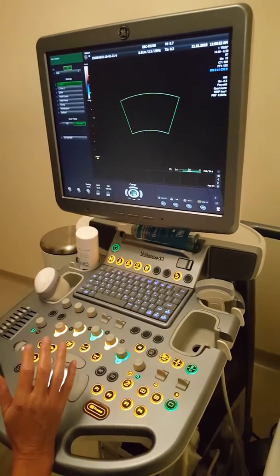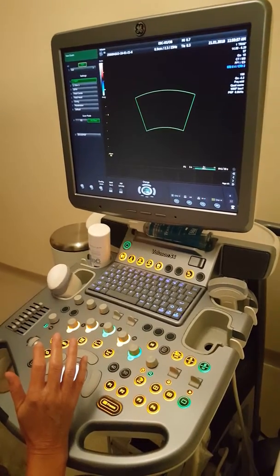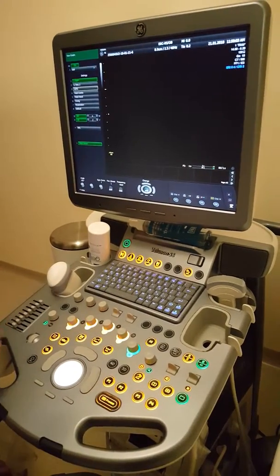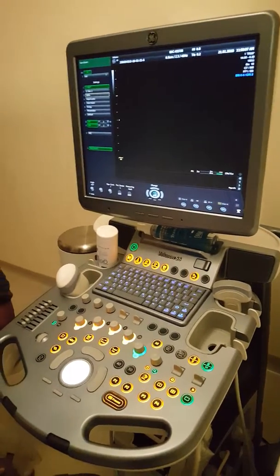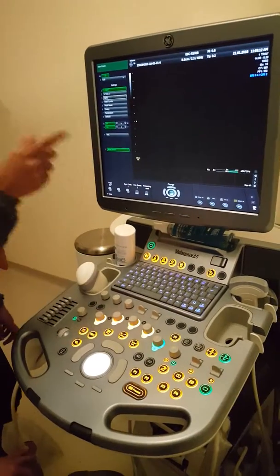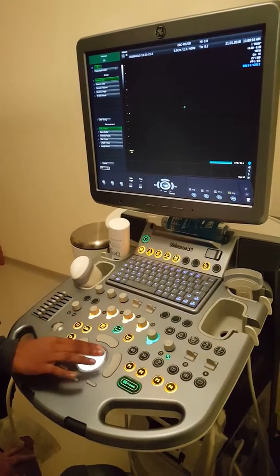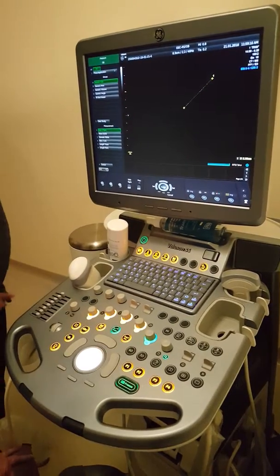Do you want it to show cervix? Do you want that to be seen as cervix? Like, for example, anything that you want to generally measure. For example, if it's cervical, do you trace or do you just take the distance? I just take the distance. So here, if you're doing an obstetric case and you want to measure the cervix, what I would do is freeze. I would just take my caliper and measure the cervix and give a printout.